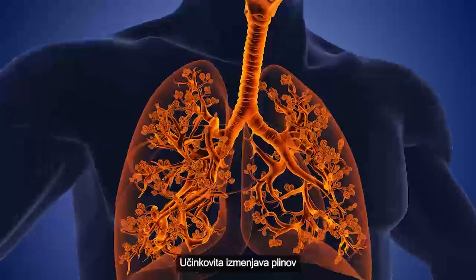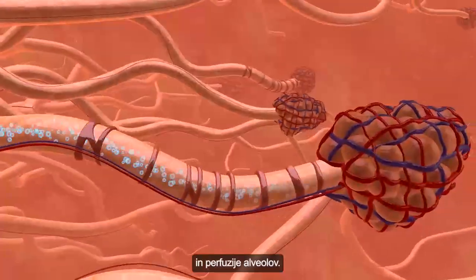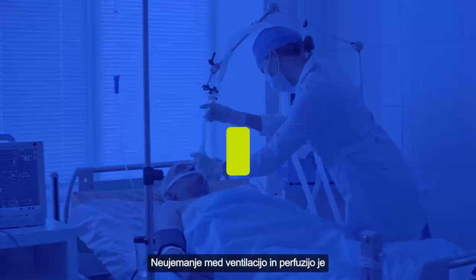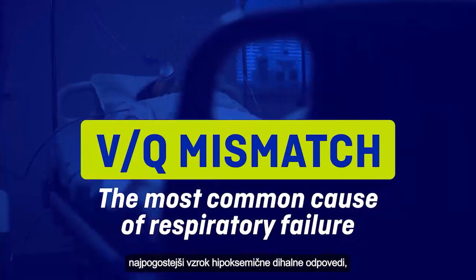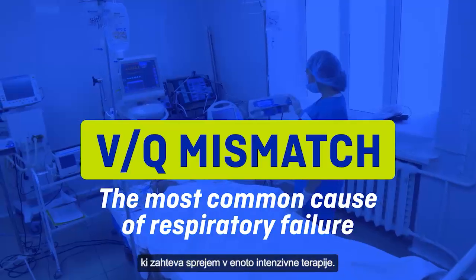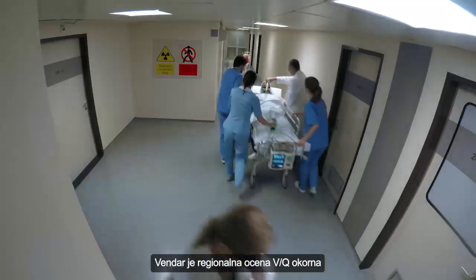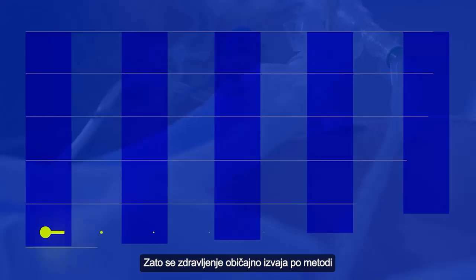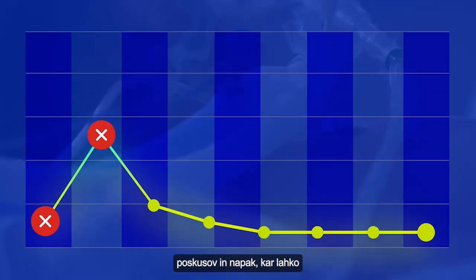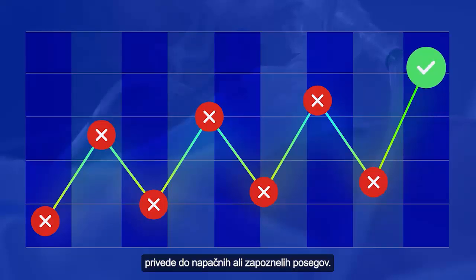Efficient gas exchange is the result of an intimate match of regional ventilation and perfusion across alveoli. A mismatch between ventilation and perfusion is the most common cause of hypoxemic respiratory failure requiring intensive care unit admission. However, regional VQ assessment is cumbersome and not available at the bedside. As a result, treatment is usually guided by trial and error approaches, which can lead to wrong or delayed interventions.